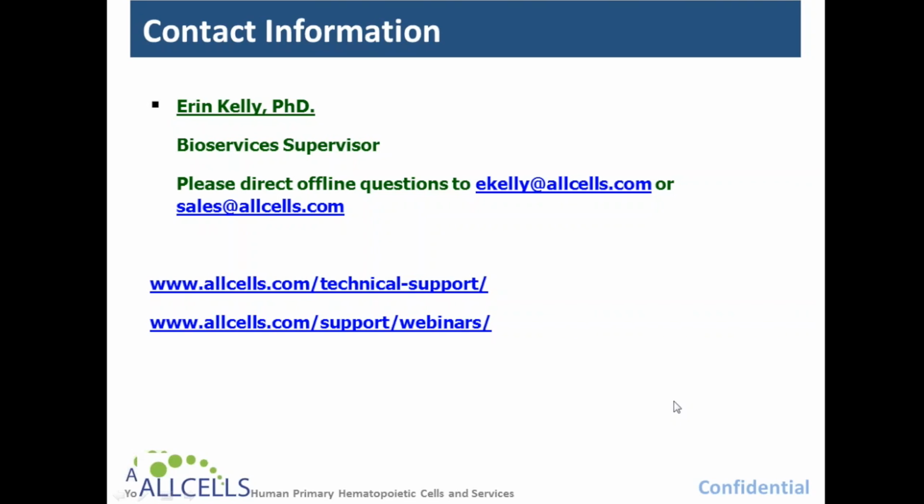That's an excellent question. In terms of thawing, a critical point that's very different between cell lines and primary cells is the thawing needs to be a lot gentler. It's easy to do, it just needs to be a lot gentler. You have to place medium in drop-wise when you wash the cells out of the freezing medium, and we have detailed instructions for exactly how to do that on our website.